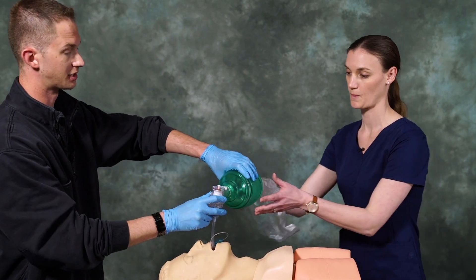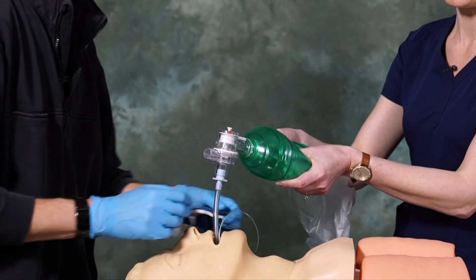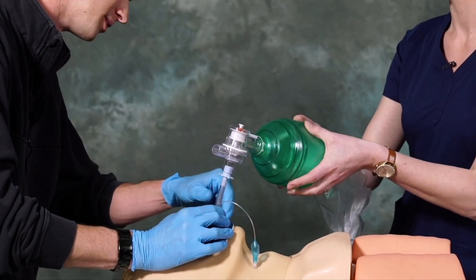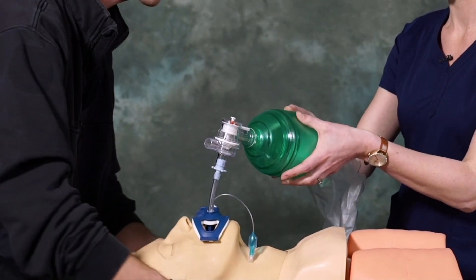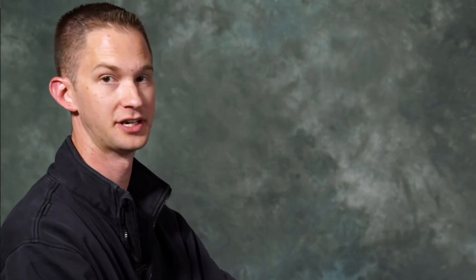Now I'm going to hand this over to Rachel, and she's going to continue to ventilate the patient while I secure the tube with the tube tamer. It's also important to note, as you're placing the tube tamer, the length of the tube. In this case, we have the tube at about 23 at the teeth, which is about normal for an average adult. We wrap this behind, and the tube is now secured. And now we have successfully intubated our patient.